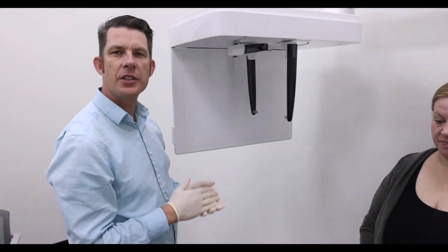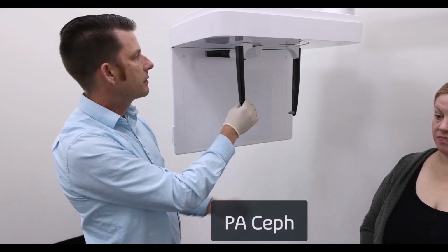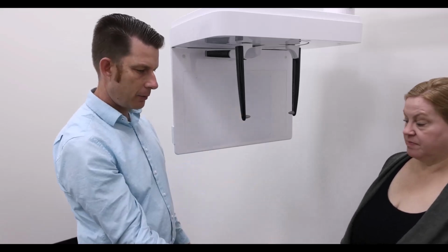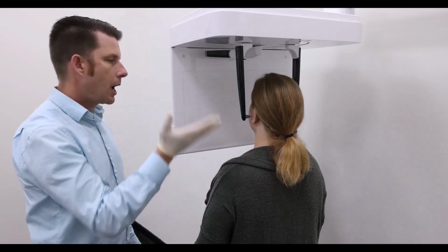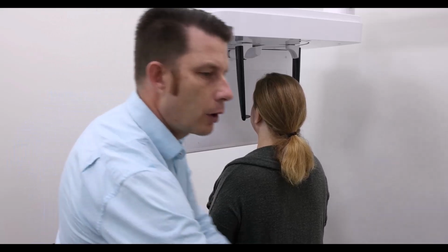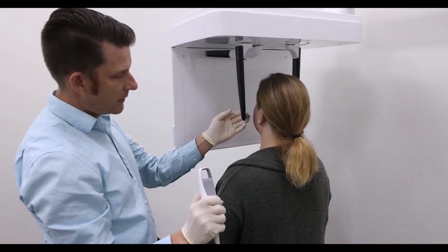Let's look at positioning for a PA Ceph. I'm going to rotate the overhead to where the patient is going to be facing the sensor. So I'm going to have you go ahead and step over here and walk forward. I want to raise the machine up either on the touchpad if your Ceph has a touchpad here, or by our touchpad or up and down here. So get this lined up right with the ear canals.